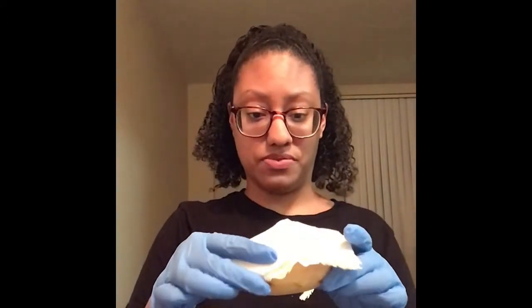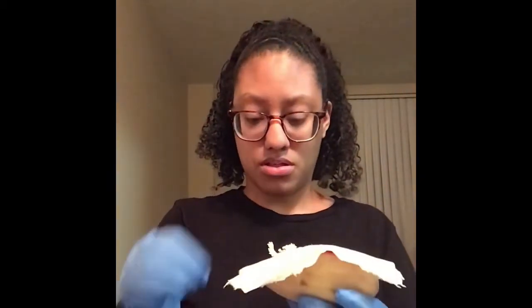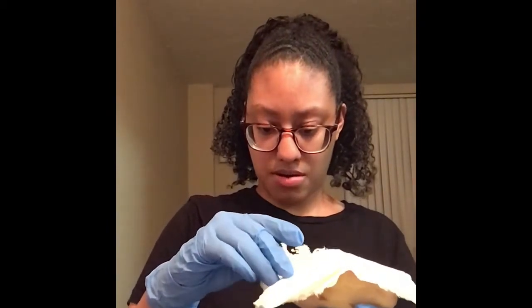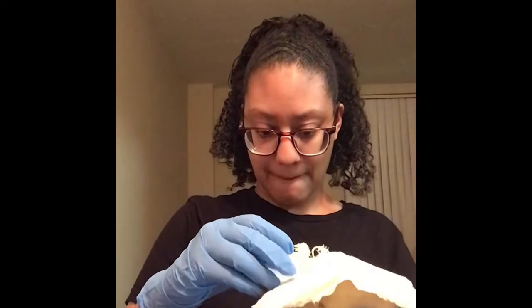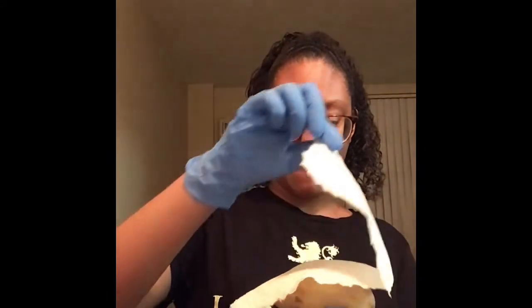So the first thing we're going to do is remove the current dressing that is on the wound. So what you want to do is remove it layer by layer. You want to make sure that you do this out of the view of the patient so that they're not seeing what's on the dressing. I'm going to go layer by layer until we get to our wound.